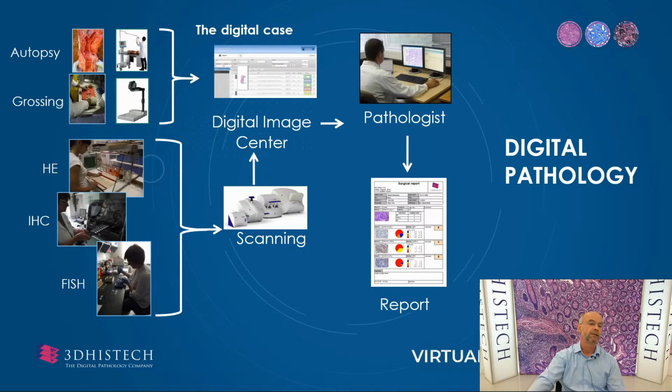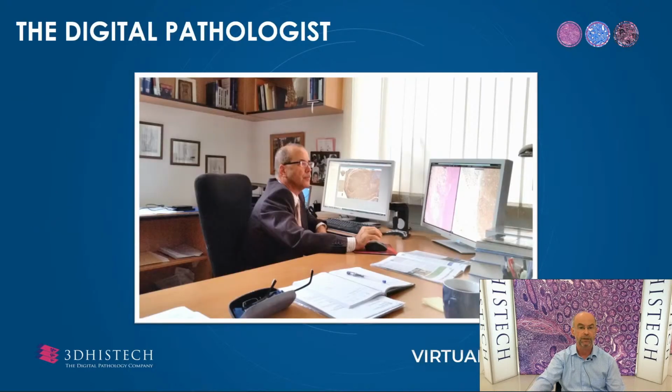case-specific collected slides from hematoxylin eosin staining, after hematoxylin eosin staining, or several later from the immunohistochemistry lab, and even if we performed and requested FISH labeling of molecular alterations, were collected, could be evaluated sequentially, discussed in oncoteams, and then even used in archives for specimen retrieval and re-evaluations.